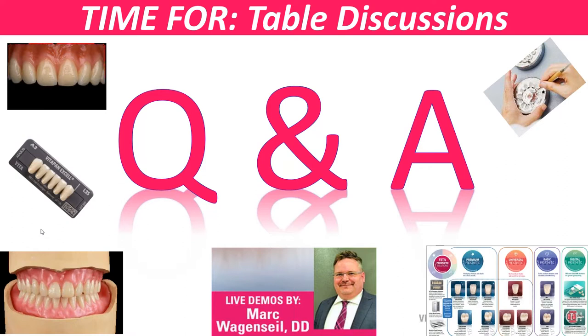The other reason that you can have a hard time identifying it is if the patient takes their dentures out and an impression is taken immediately, the tissue is still somewhat compressed. So if you're a denturist, have them leave the teeth out longer before you take the impression. It's going to be hard in a dentist's office to ask for that, but if you can have the patient leave the denture out, or come into the office without the denture in, or leave it out in the car ride over, quickly put it in, run into your office, get them seated, take it out again immediately, you're going to take the impression over less compressed tissue, and those rugae will pop even more.